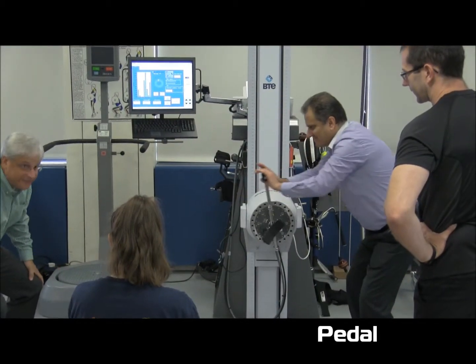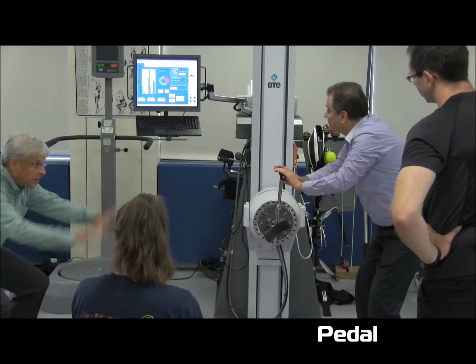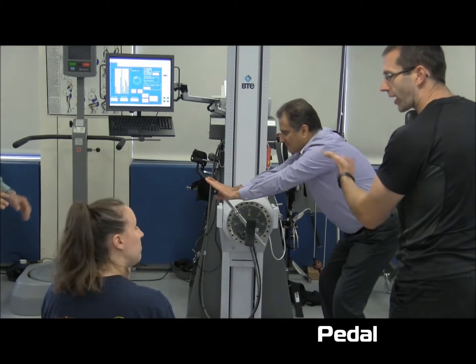What you're working for is that stability in the ankles, knee, hip — and you're right here. We're not doing much. It's eight kilos. That's what we're doing. It's quite a surprise.